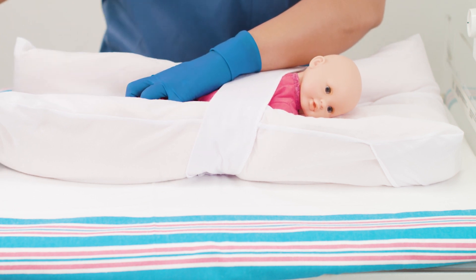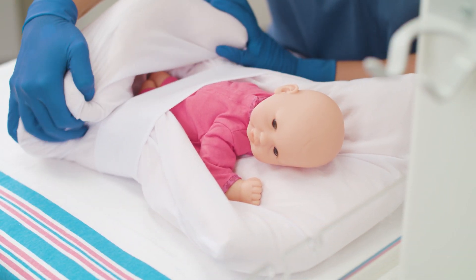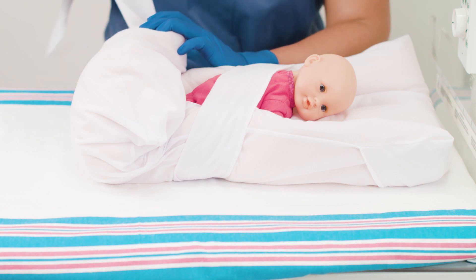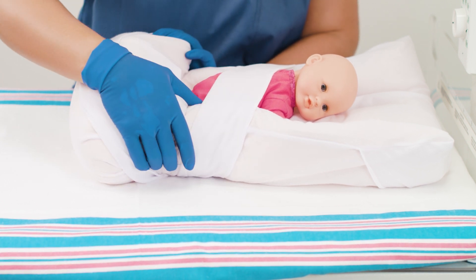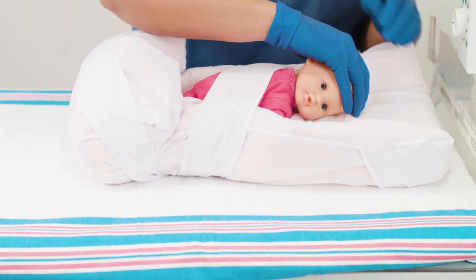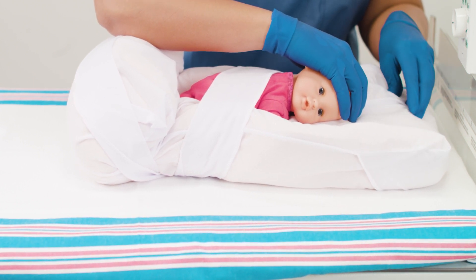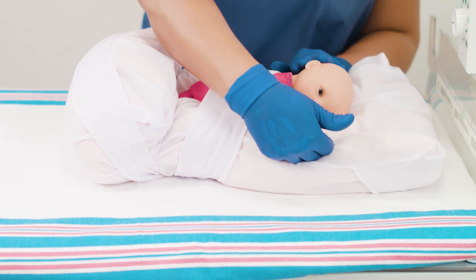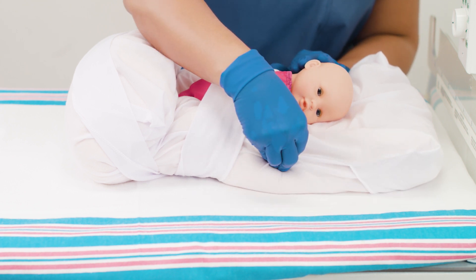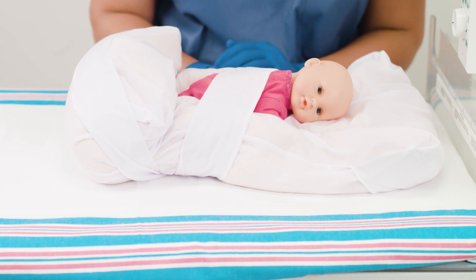While cupping the baby's feet, make a small crease to ease bending and create an encasement for the legs by raising a boundary from the bottom of the positioner. Wrap the second strap around the bottom of the positioner and secure. Mold the positioner to conform closely to the baby's body. Depress the positioner around the front of the head so the face area is clear. Using your finger, create a small indentation for the down-facing ear. Finish by ensuring that the head is well supported and breathing is not obstructed.